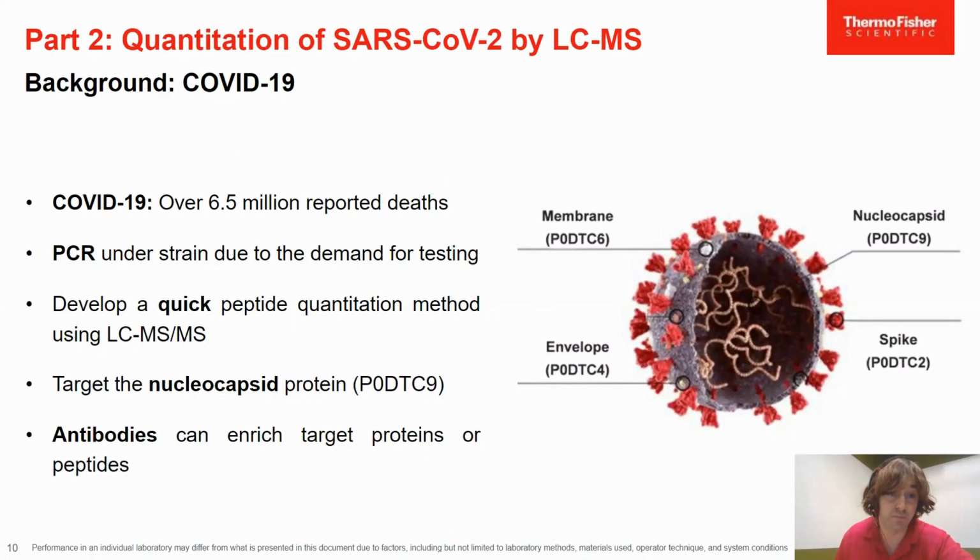So now, given a bit of an introduction into what protein quantitation is, and specifically bottom-up protein quantitation, I'd like to move into the part of our talk regarding quantitation of SARS-CoV-2, the virus that causes COVID-19, by LCMS.